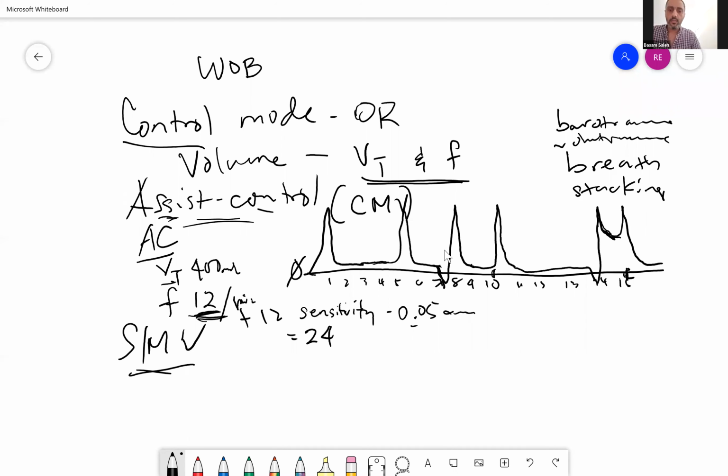So does your patient stay on the same mode the whole entire time? No. The patient must be evaluated every hour routinely. Is the patient still receiving appropriate therapy? Is the AC still appropriate for the patient?